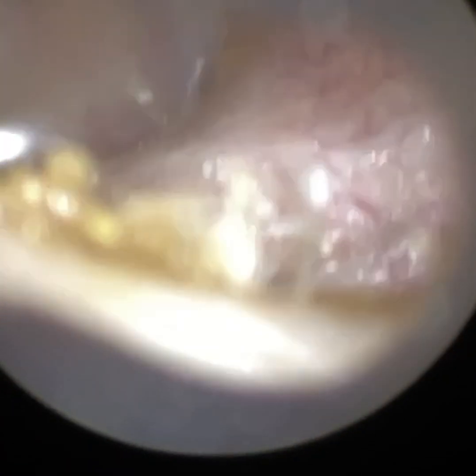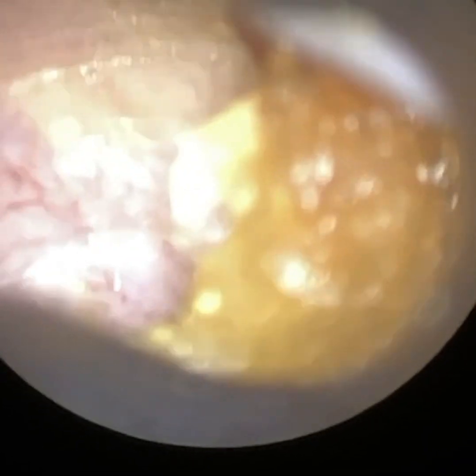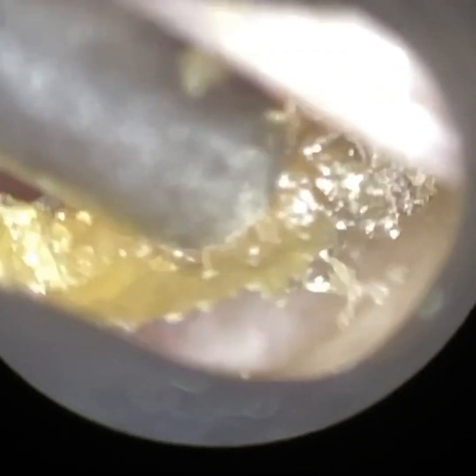There's no feedback after the procedure, so the patient's happy. I'm just going to stretch the ear open and get the eardrum in focus now. You can see just how focused that is. There's just a bit more keratin there, just at the base of the ear canal on the inferior aspect, just past the first bend of the ear canal. So I'm just using a fine end here, just gently teasing that away.